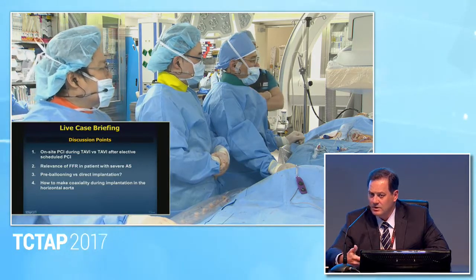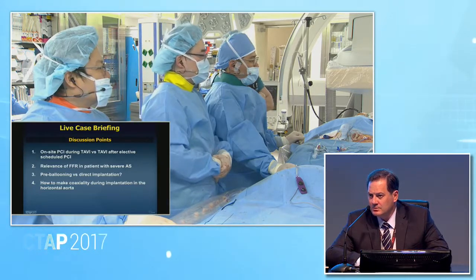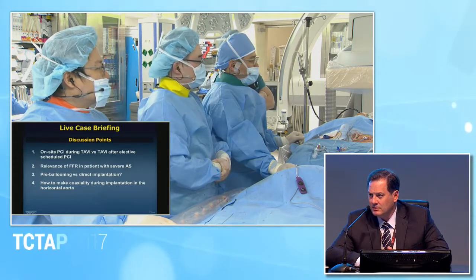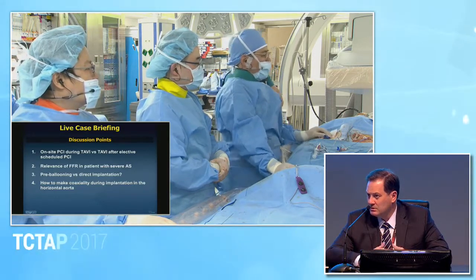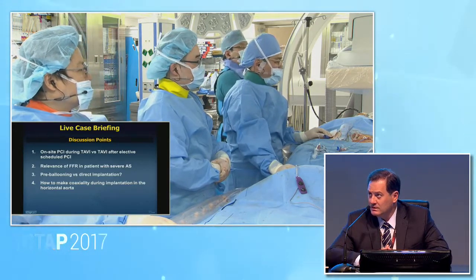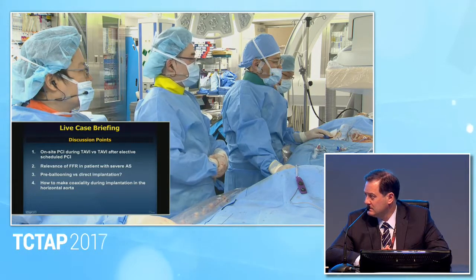And so I think if you know the patient has coronary stenoses, it's very simple to schedule this in, have it done as a part of a preparation for transcatheter valve replacement. While it is possible, and we have done combined procedures, it really does interrupt the whole flow of the patient for the day.